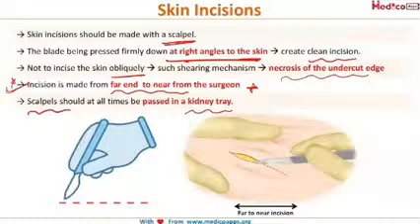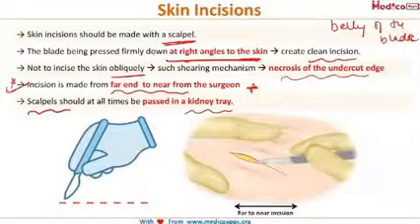And another important point I want to mention, which usually students go wrong with, is that the sharpest portion of the blade is the belly of the blade. Yes, do remember this point, that the sharpest point is the belly of the blade.